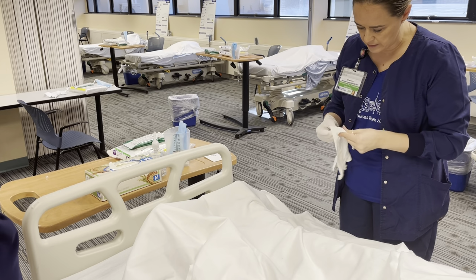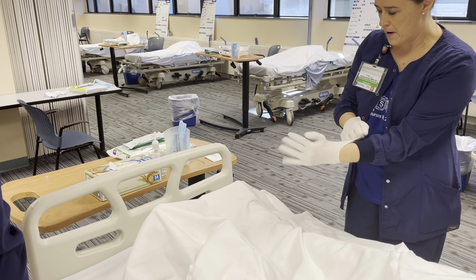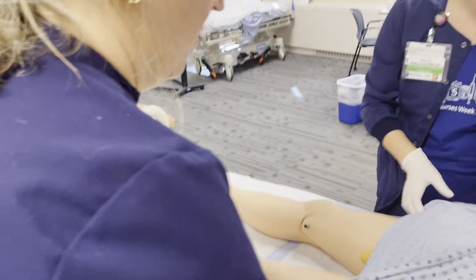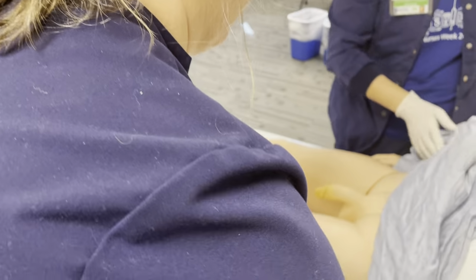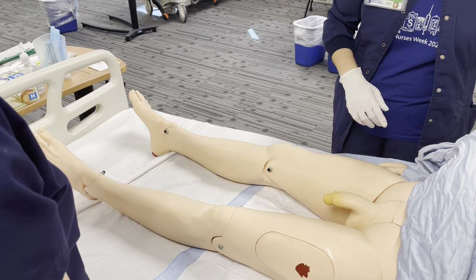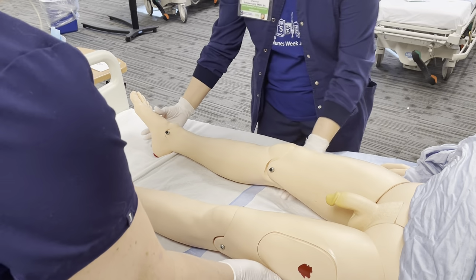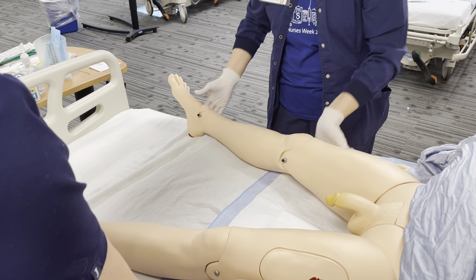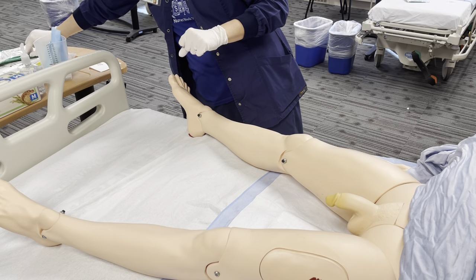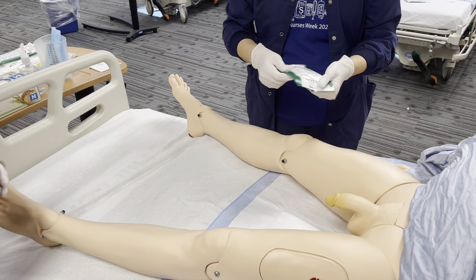Okay. Janine and I are just going to lift your covers up from the bottom here and expose your peri area. Might be a little bit cold. I'm going to lay your head down just slightly as well. And we're going to get you into position simply by opening your legs a little bit. All right, is that okay? Yep. Okay, good. So first we're going to start cleaning with our barred wipes.